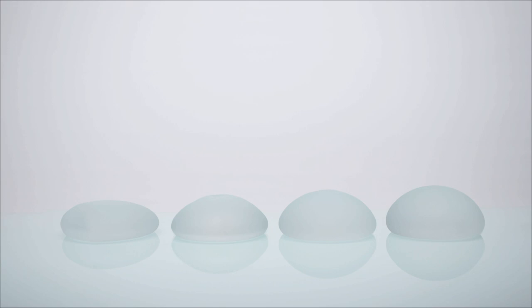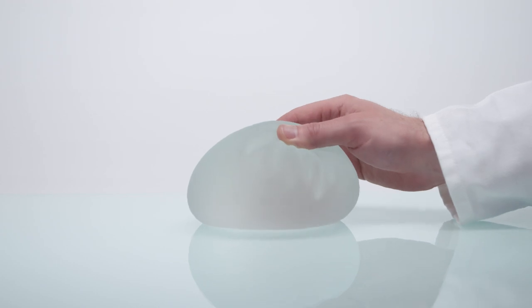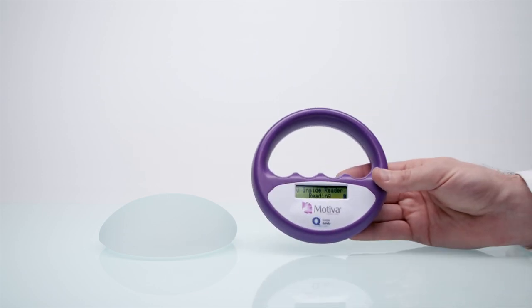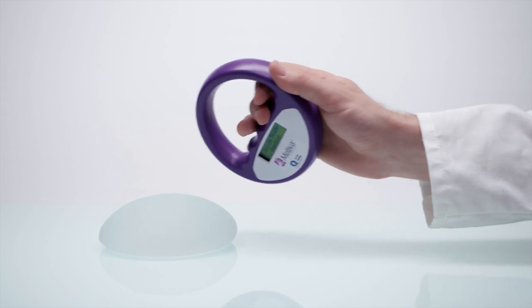To make it easy for patients and surgeons alike to access implant information, we created QID, a 12 mm-sized chip placed within the implant. Your surgeon can then use a special reader to read the chip and easily obtain detailed information on the implant and its guarantees.